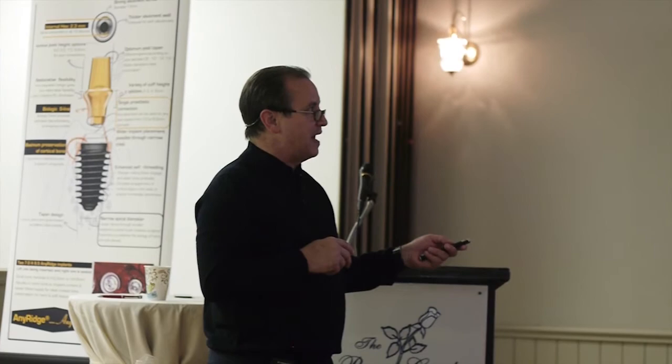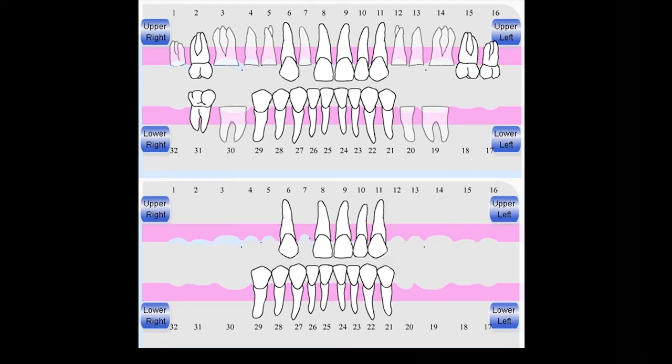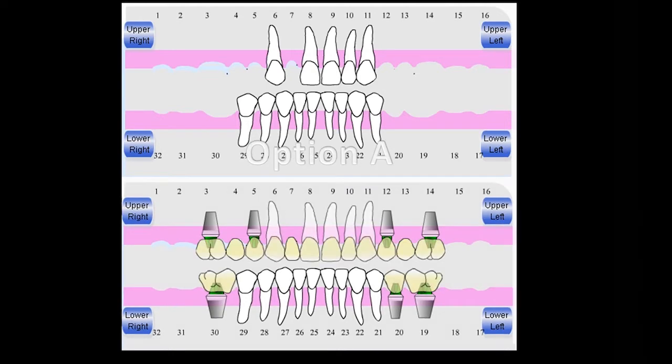This is what you got, Scott. This is all that's left. In fact, I forgot to knock out 10 because 10's in bad shape also. So here's what you got. Here's really all that's left, and 10's history also. And so what we think about is putting implants in these sites, fixed bridge work in the front. That's option A.